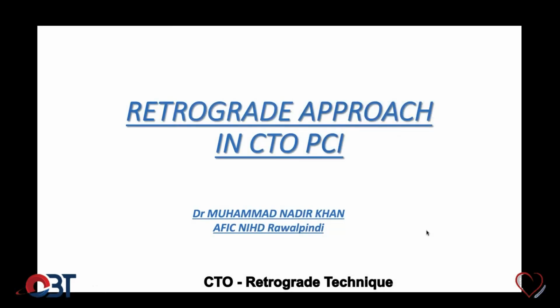It's a very nice case. It's always about thinking of retrograde technique. Why not first try this patient with the antegrade technique? It was already tried, but I just showed you the retrograde technique because our discussion was on retrograde. So according to the hybrid algorithm, it was initially started antegradely, then we failed, and then we went retrogradely. Okay. Sir, one more question, please.